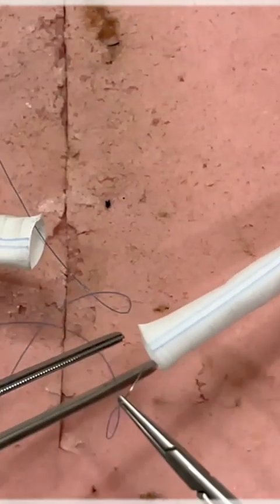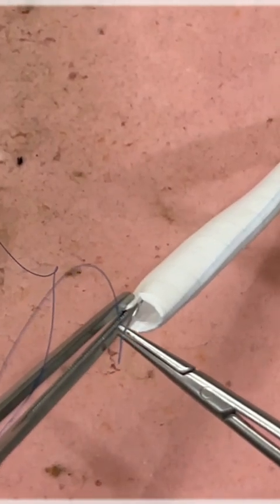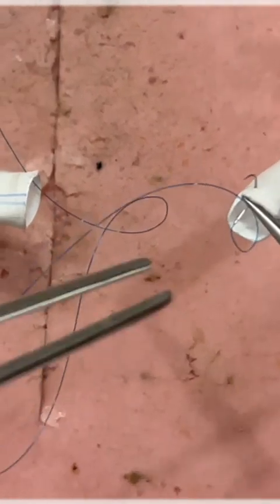Here I have relatively fixed the artery, so the manipulation may be difficult, and I'm doing it alone, so there is no expert assistance available. In real life, you will have good assistance and you may be able to do it with a little bit more ease.